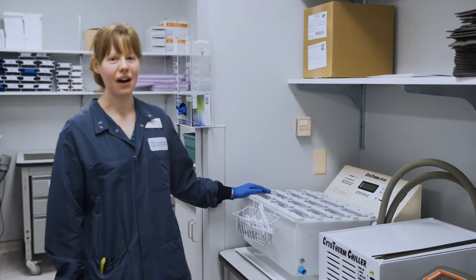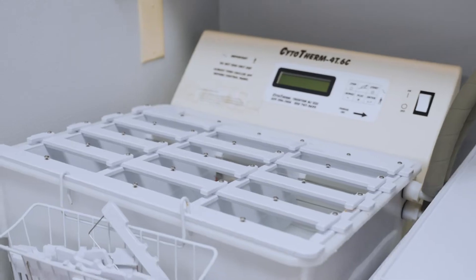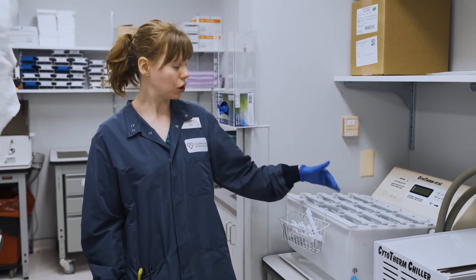This is one of our cryo baths, our water baths. When we make a product called cryo from whole blood plasma that has been previously frozen, we need to thaw it out, so we load it in here.